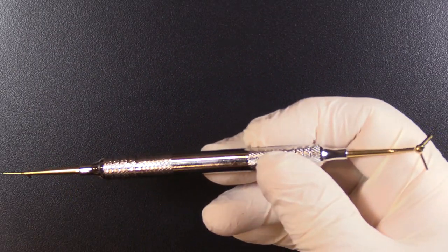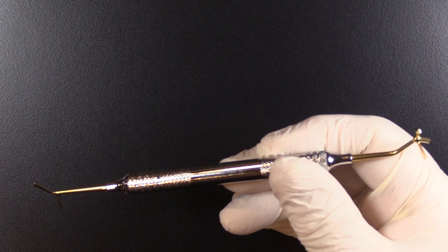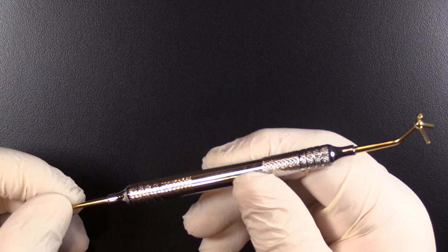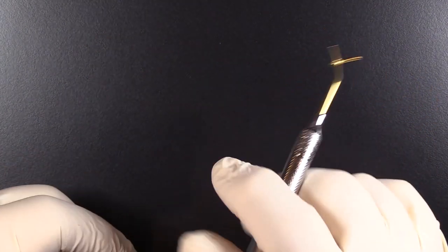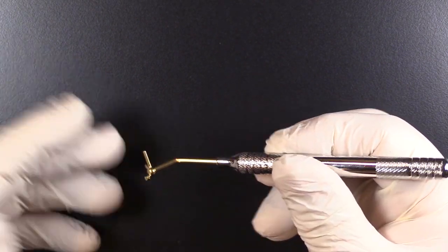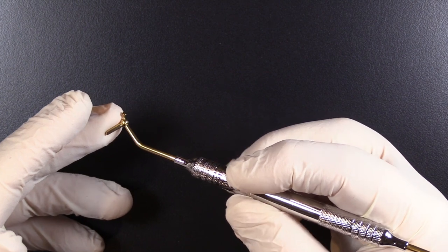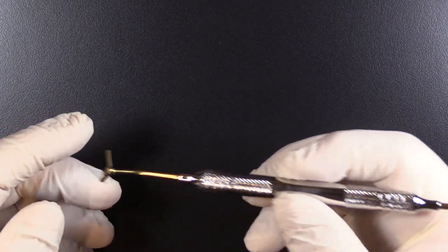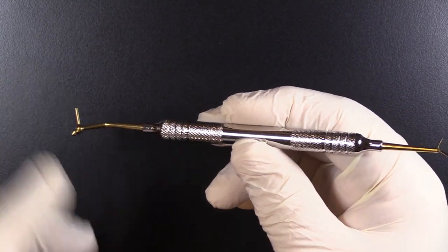It's the only instrument like it on the market, and certainly one that whenever we are using it — like if I'm doing a CE course with our sectional matrix system — I'm using this instrument where it's called for in the presentation, and it generates a lot of questions. At trade show booths, people walk by and they see this and they come over asking what it is. Well, it is the Multifunction Composite Instrument.